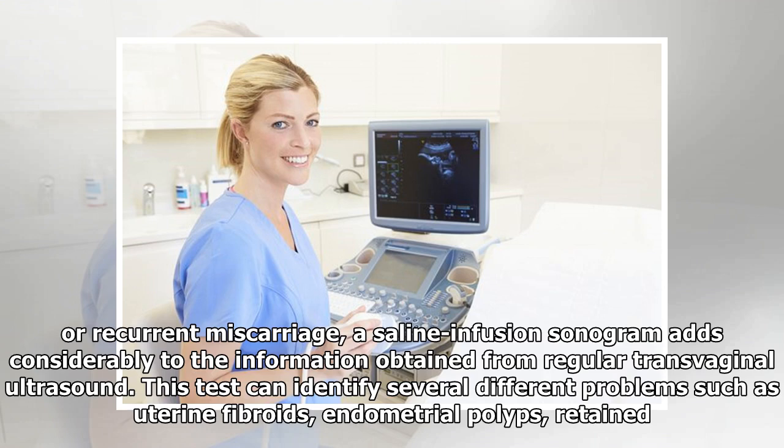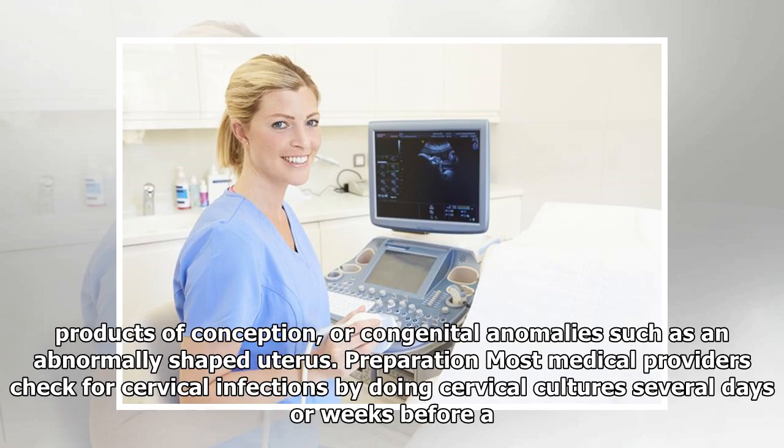This test can identify several different problems such as uterine fibroids, endometrial polyps, retained products of conception, or congenital anomalies such as an abnormally shaped uterus.